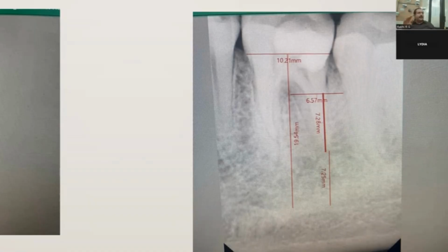That means that area has a lesser chance for resorption when you have a higher bone area on the distal portion of that particular implant. So that's going to be subcrestal considering the 6 and 7 region, but equicrestal to the interradicular area. So 7 is okay. Then you will start getting some amount of resistance from the apical area, but there is an infection in that region that has to be considered.